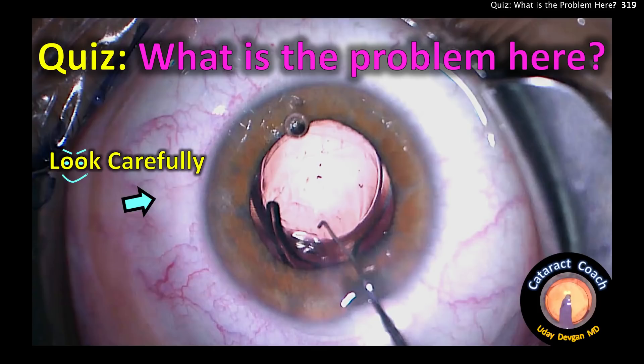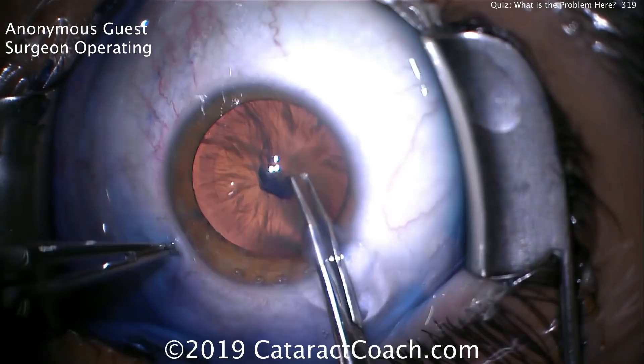What is the problem in this picture? Look very carefully — you should be able to figure it out. Let me show you this case.